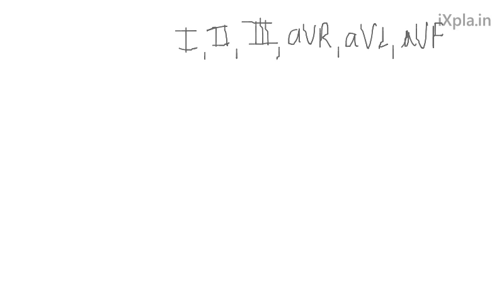Because when you do the written example, she gives you a 12-lead EKG, and she tells you what she wants to know. She doesn't trick you with anything. She'll tell you she wants to know the mean axis and the axis deviation. So you'll see your 12-lead EKG and you have to be able to calculate. First, you want to look at lead 2 and AVF, and calculate the axis deviation by what we did in the video. Based on the axis deviation, you write it down, and then you calculate the mean axis based on it.